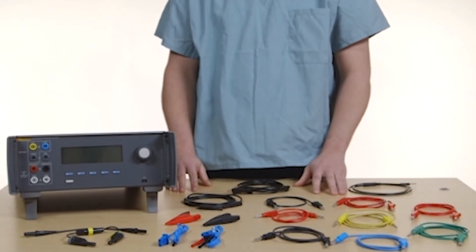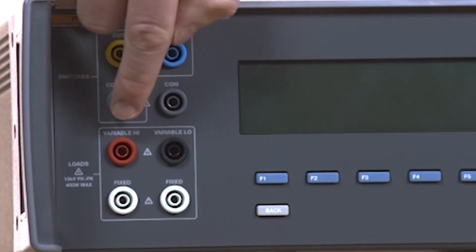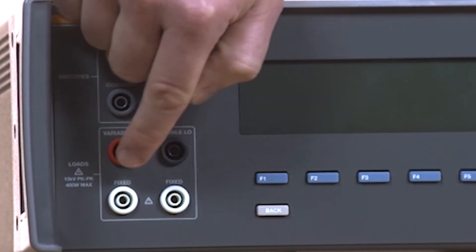The CQM or contact quality monitor connection is below. Clearly labeled are the load connections: variable high, variable low, and fixed.